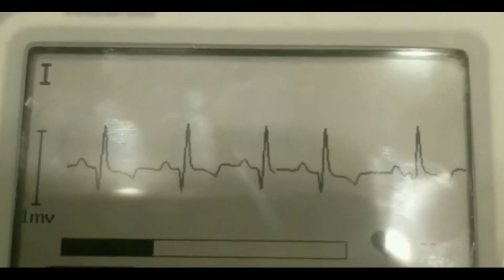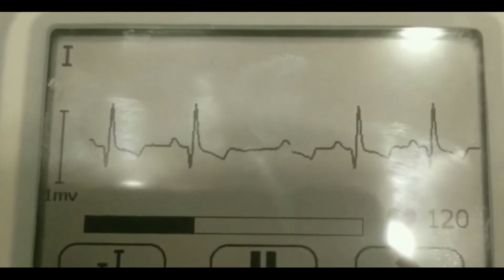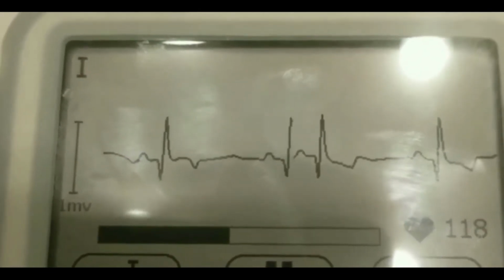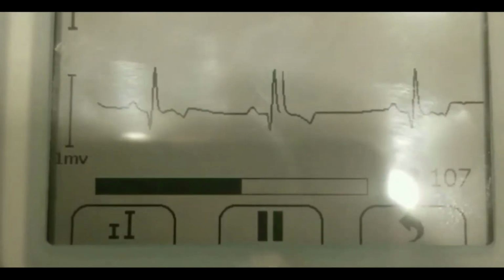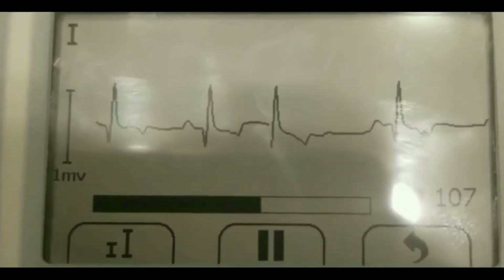Next follows the PR intervals. In this step, you should measure the interval from where the P wave begins until the beginning of the QRS complex. You will also want to evaluate if PR intervals are constant or varying across the ECG strip. Followed by the PR intervals, there is the QRS complex.